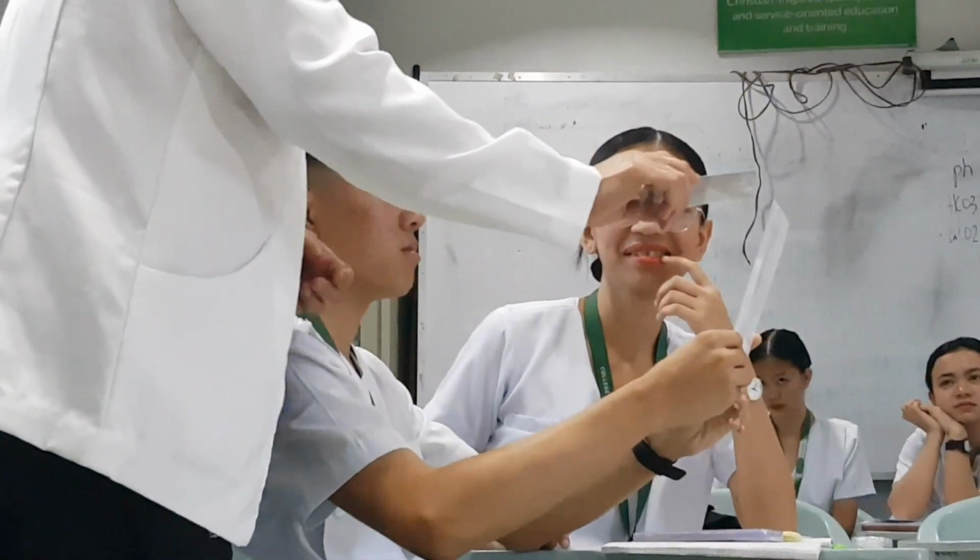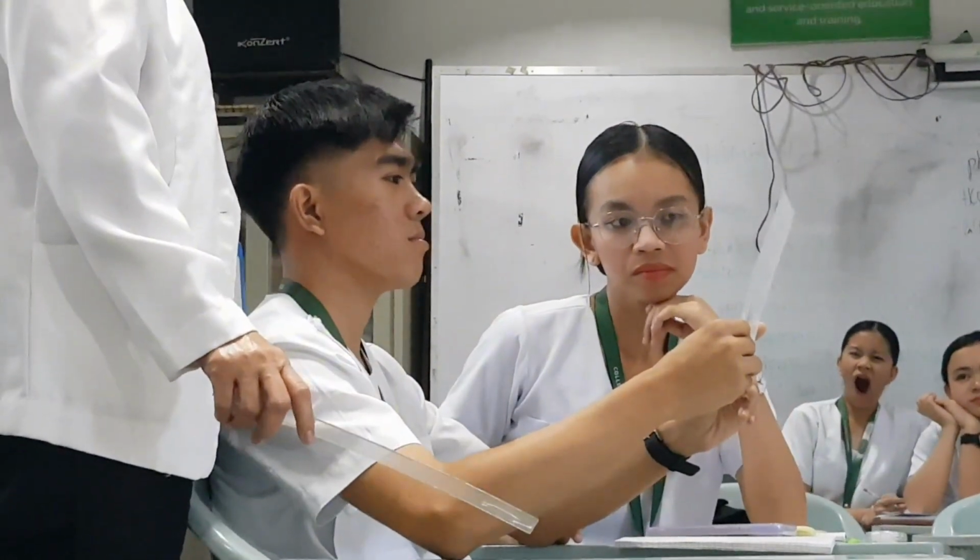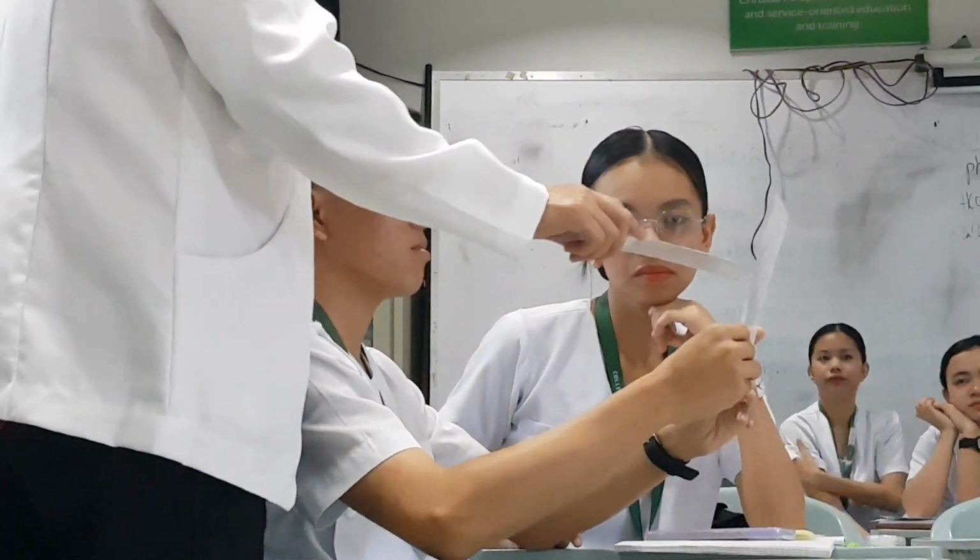So, saan mo mababasa yan? Anong one mo dyan? 1, 2, 3, 4, 5, 6. Number 3. So, number 3, you can read number 3. Okay. Means that is now your measurement of your eyeglass, 0.62 m.